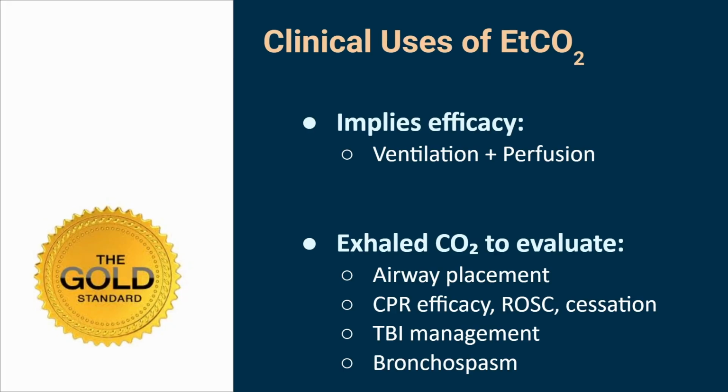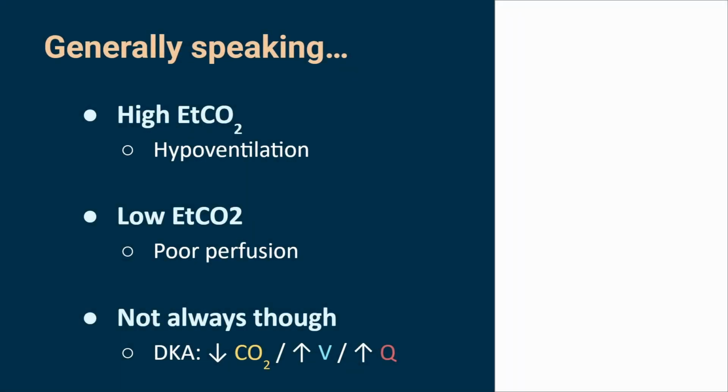If you walk up and a guy has no head, you're going to stop before you start. What does it matter? He's got no head. Put simply, if a guy's end tidal never gets above 10 in a cardiac arrest, it is like he's decapitated. His cells have stopped metabolizing and they will never work again. Less than 10 for 20 minutes.